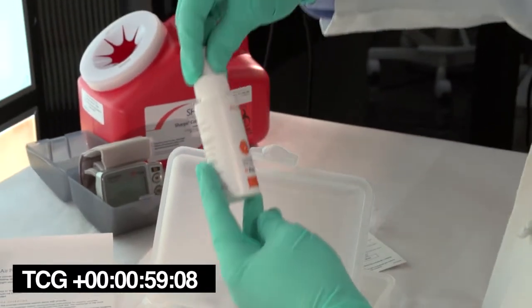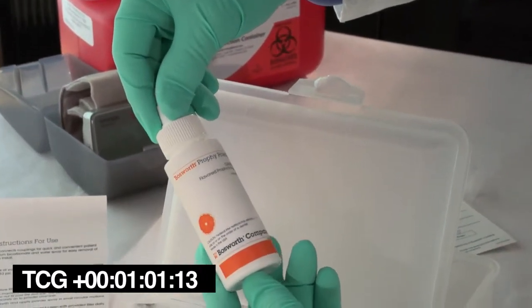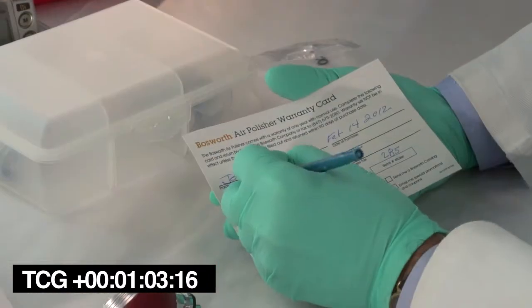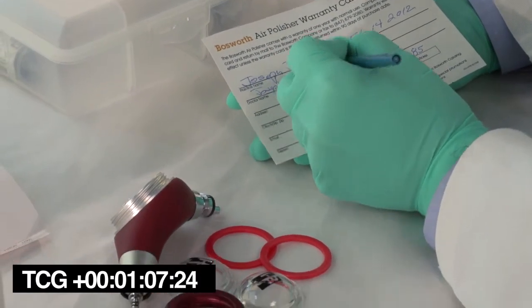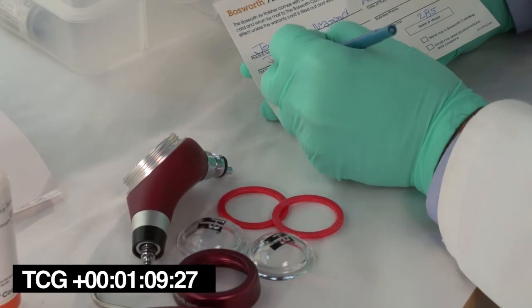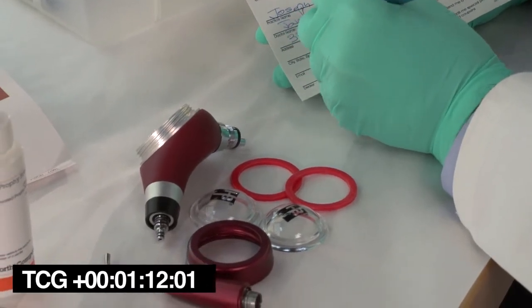A sample bottle of Bosworth Profi powder is included for your use. Please fill out your warranty card and return to the Bosworth Company. Your warranty is valid for 1 year from the date of purchase.